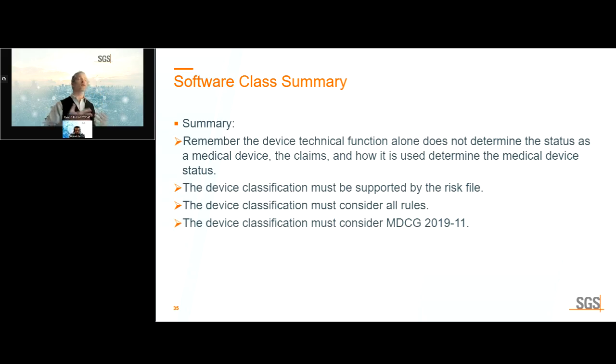So in summary of this section, remember your device classification has to be supported by your risk. It must consider all the rules. You must look at the MDCG 2019-11 to get it right for software. And technical function alone doesn't make you a medical device. It's the claim that really impacts you.